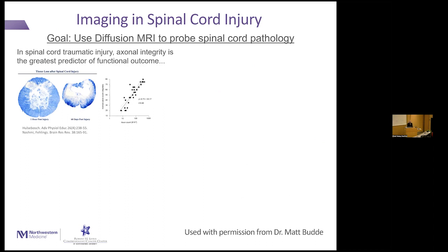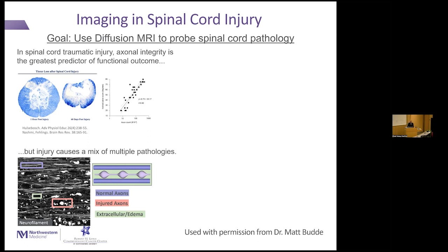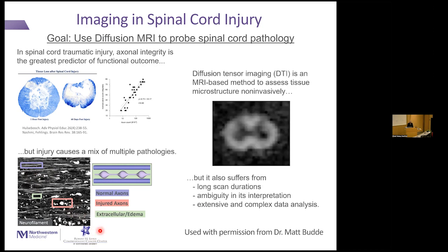And this is a spinal cord example, which makes more sense than doing something with a tumor. You wouldn't imagine a whole lot of directionality with something like a tumor. This was in collaboration with some colleagues at Medical College of Wisconsin. This down here gives you a better idea of how the directionality could be picked up with DTI. This is a spinal cord injury where this is the injured axon right there, and that's what the image looks like.